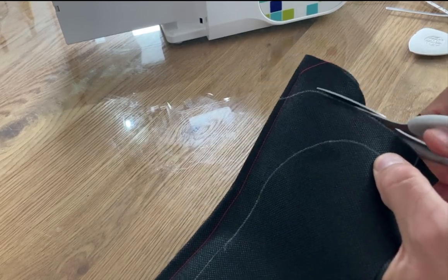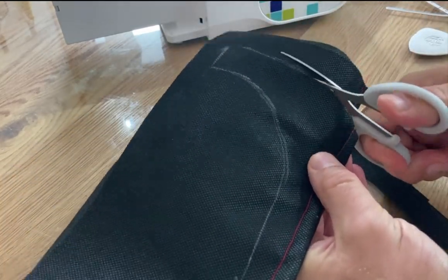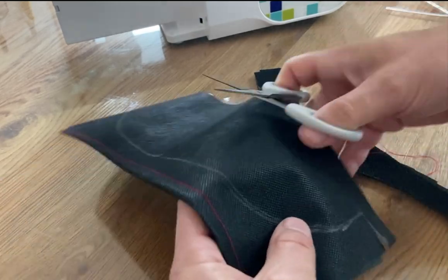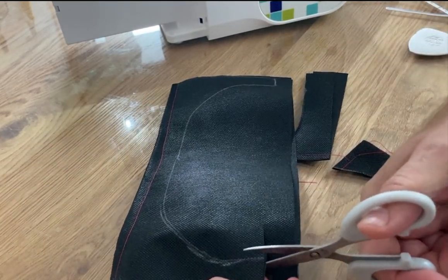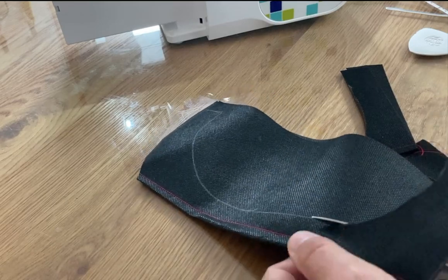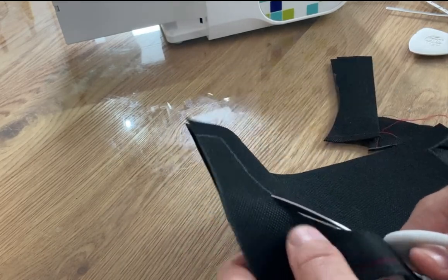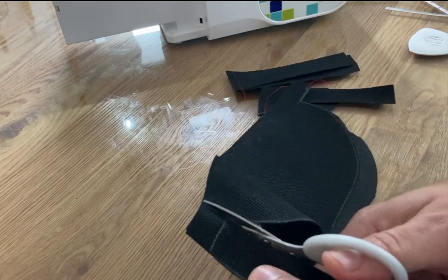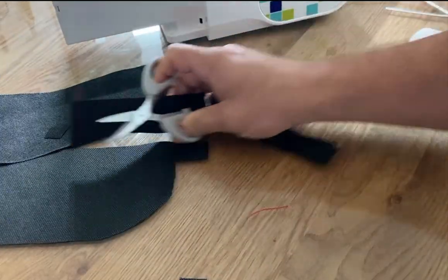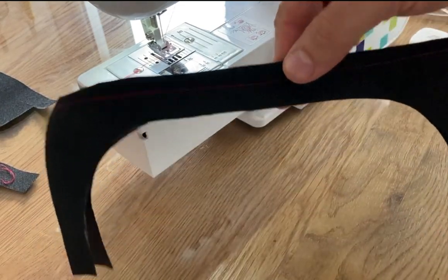This stuff doesn't fray at the edges. If this was any other material that was woven, it would fray. But we can take advantage of this non-fraying material and leave these edges as is. Or we could put a zigzag stitch, I can't remember what that's officially called. If you're sensitive at your skin, you probably could feel these unsewn edges, but I'm not too sure how much of an improvement the zigzag would be for this material. Anyway, so that's where we are.